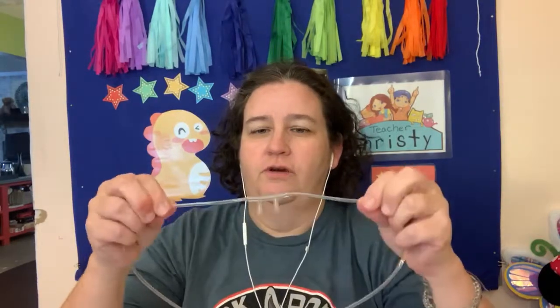The nasal cannula goes with the curvature into the nose. When putting it on patients, I get it lined up and hold here, put it behind one ear — hold it because if you don't hold it you're pulling on it and it's awkward — then put this one behind the other ear and tighten the bolo. That's one way to do it.